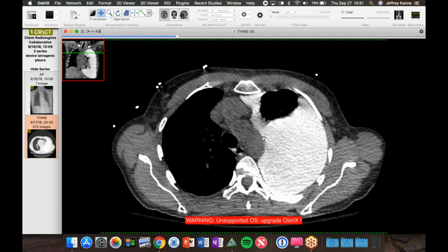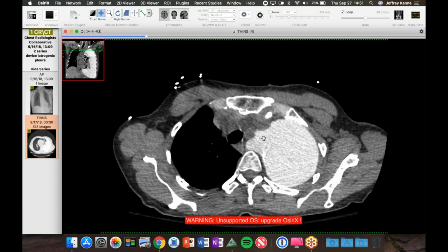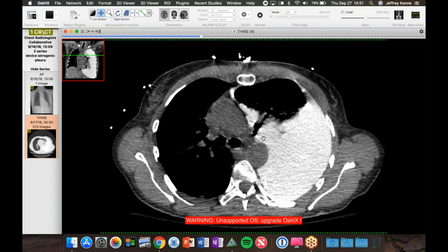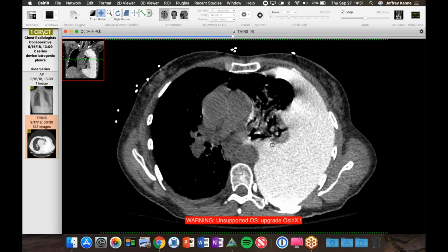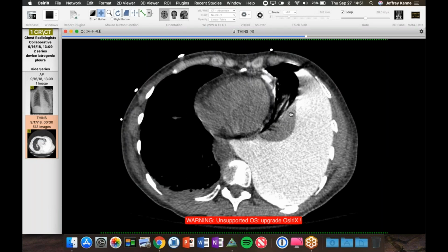But even though we report these, we hopefully call when it's this concerning. Somehow at some other institution the communication broke down and this was injected. So this is the full 100 or 150 cc's of contrast. Unfortunately, I don't have a radiograph to show this, but it almost makes you wonder, could you do a contrast pleurogram with a dilute contrast to look for pleural tumor?